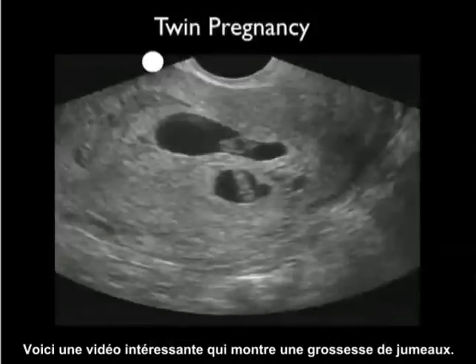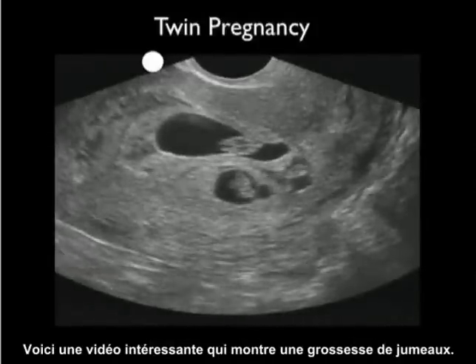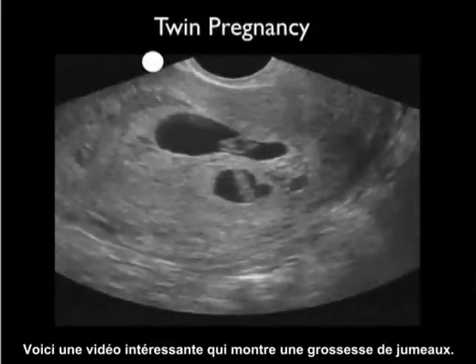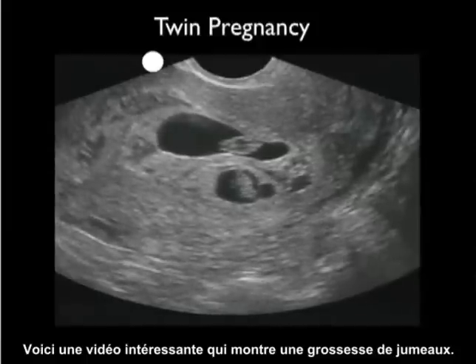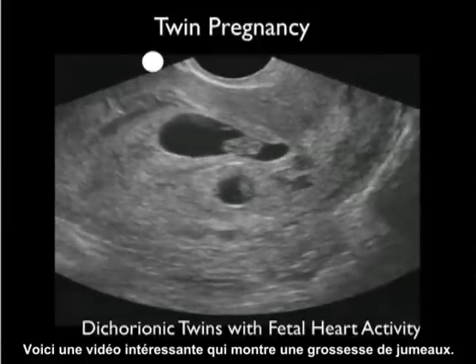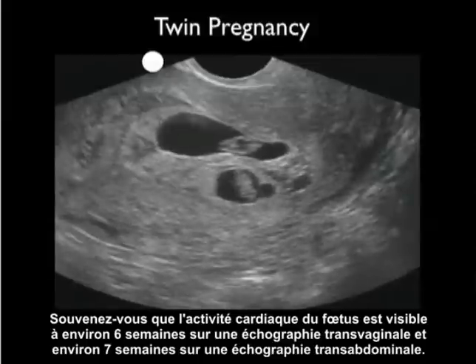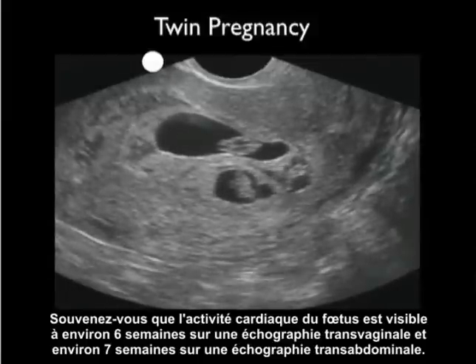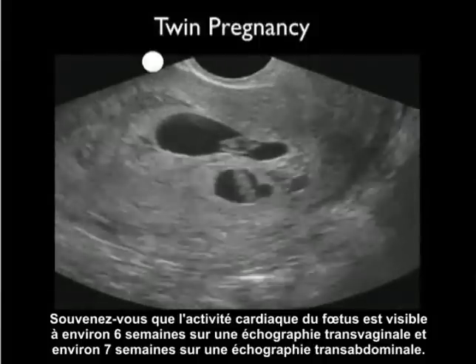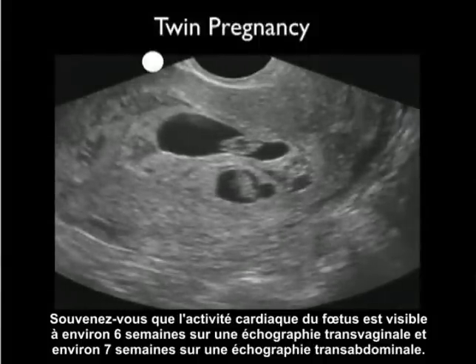Here's an interesting video clip showing a twin pregnancy. What we see here are two gestational sacs signifying dichorionic twins, and within each of the gestational sacs we can see little fetal poles with a flicker of heartbeats. Recall that fetal heart activity is seen at about 6 weeks on transvaginal sonography and about 7 weeks on transabdominal sonography.